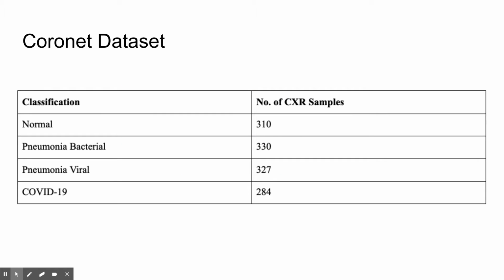For the experiments we run, we employ the dataset provided by the authors of CoroNet. It includes 4 classes, including subsets of pneumonia. The images have been resized to be equal size and resolution, and it's already divided fairly evenly between classes and prepared for running training, validation, and testing experiments. In terms of dataset size, it compares well with other publicly available datasets as well.